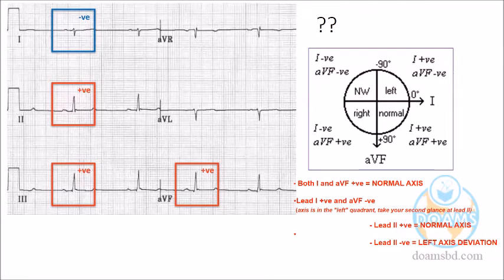There is another technique also when you fix the ECG by your hands. So it is up, it is down. What could it be? AVF is positive, lead 1 is negative, could be right axis. Exactly, doctor, right axis deviation. In addition, you can look at lead 2, it is also toward the right, up. It is strengthening the features. Lead 1 is down, but lead 2 is not down, it is up as usual. So it could be right axis deviation.